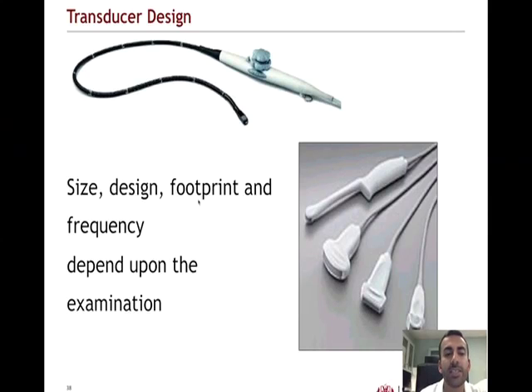In addition to these are the physical aspects of the ultrasound probe. You'll then look at the frequency that should be identified on older ultrasound probes to help determine which probe is appropriate based on which point-of-care ultrasound exam you'll be doing. This is an example of the common ultrasound probes that we regularly see throughout the hospital. We have our transesophageal echocardiogram probe designed to have a very small footprint right here. We'll talk about that more in a second.